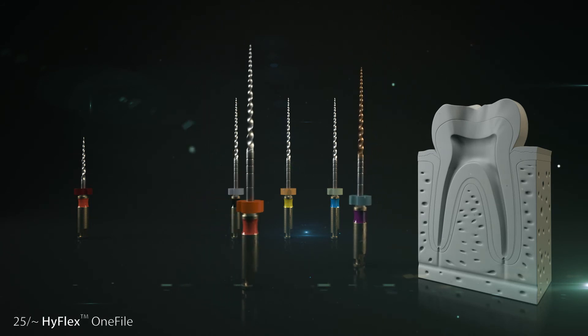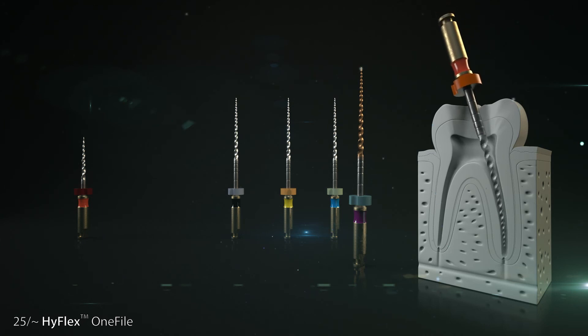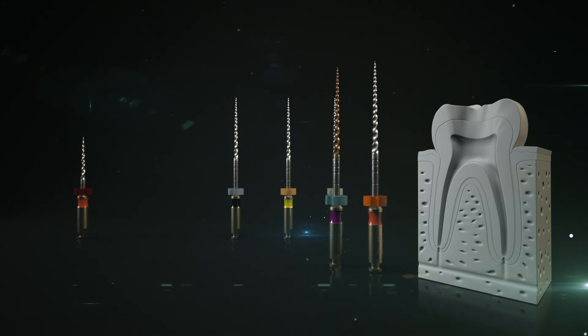Step 2: The HyFlex EDM1 file is used for the final preparation in the middle and apical areas of the root canal. Here again, the dentist uses the file up to its working length with cautious up and down touching movements. Regular rinsing during the treatment helps to remove the dentin and generally enhances the ability of the files to glide along the canal.